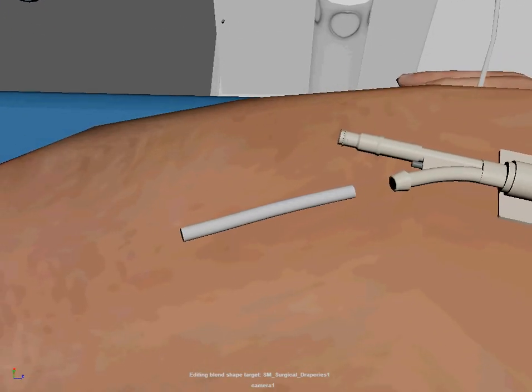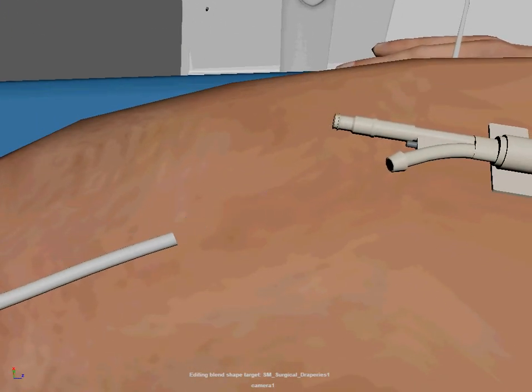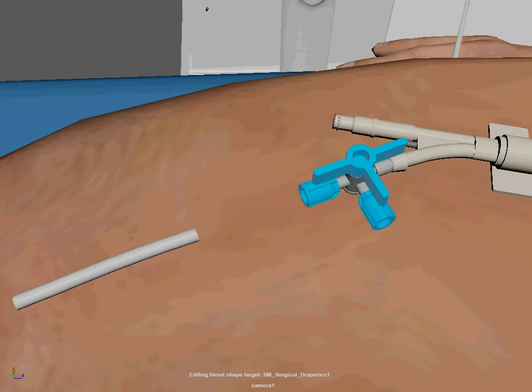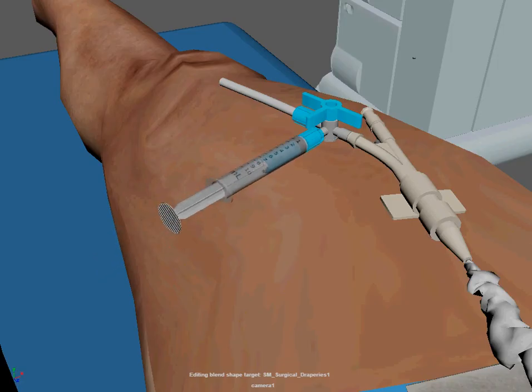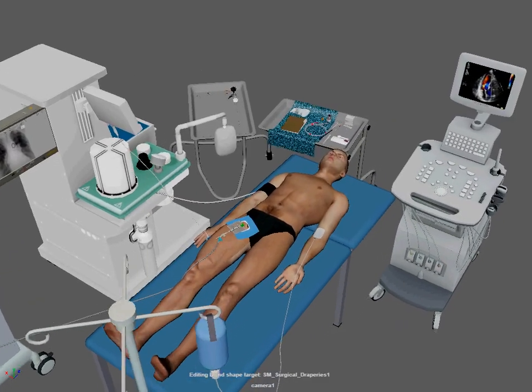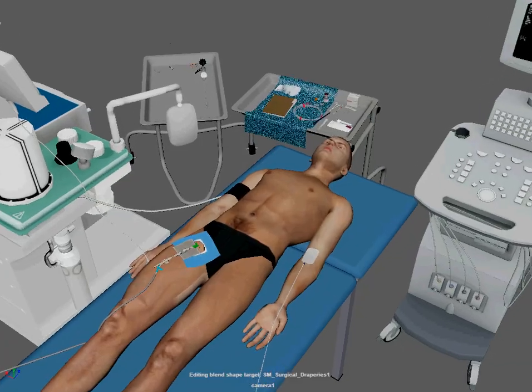Now remove the wire and attach the three-way stopcock, connect the tubing to the transducer, and flush the lumina of the pressure tubing and balloon catheter. Please ensure the completion of all connections between the tubing and the console.